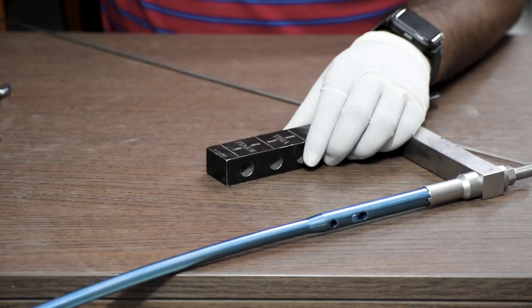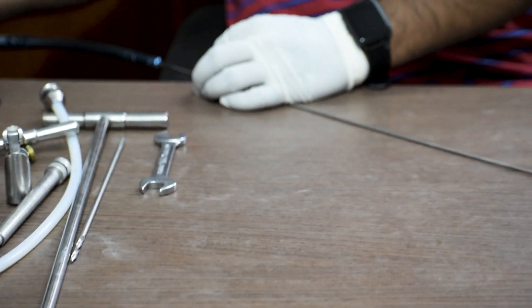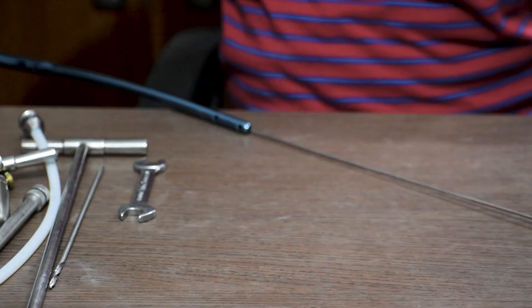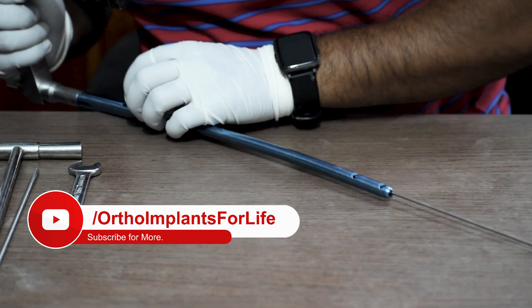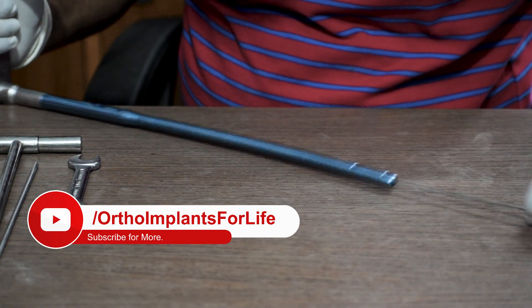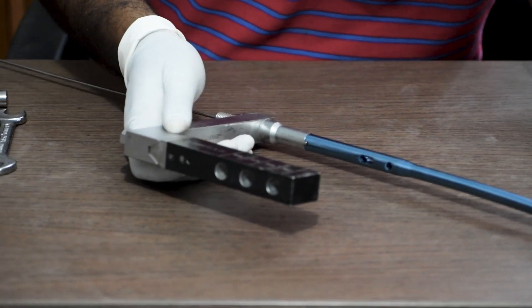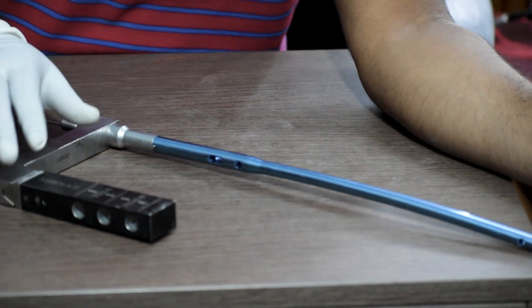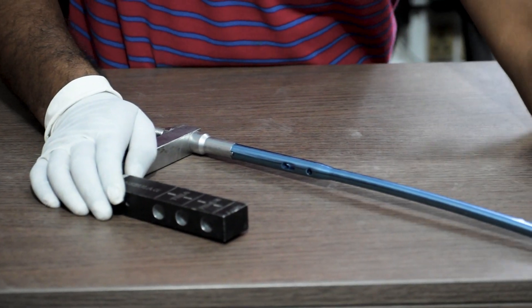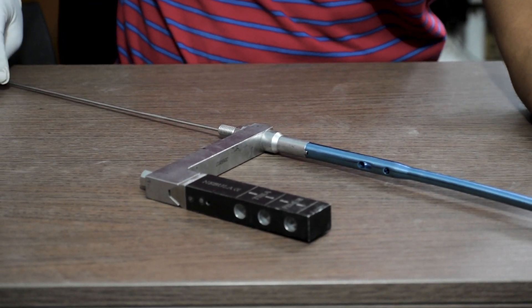After the check, we remove the protection sleeve and drill sleeve, and then insert the nail through the entry point with the help of the guide wire along with the jig. Once the nail is inside the canal, we remove the guide wire from the proximal side of the nail.